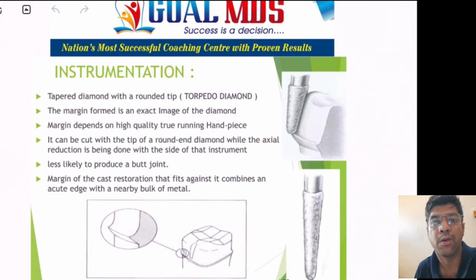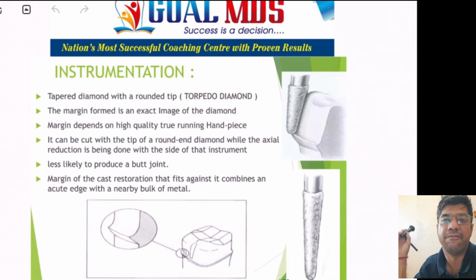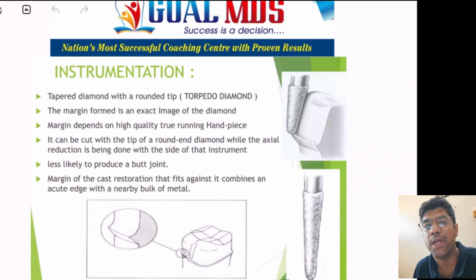Because it has an accurate fit. The chamfer margin will provide a precise margin that will allow for accurate adaptation of the restoration material, ensuring a secure and snug fit. So it is important for the cast metal restoration, where a proper fit contributes to the longevity and the functional integrity of the restoration.